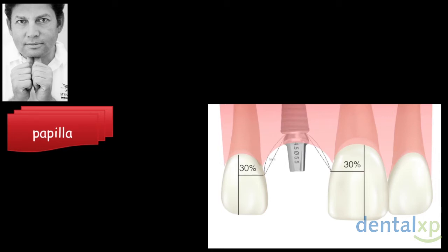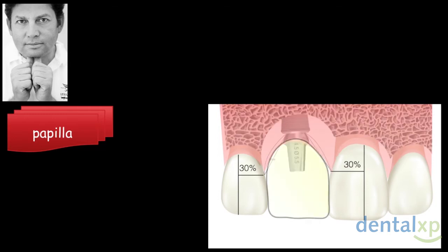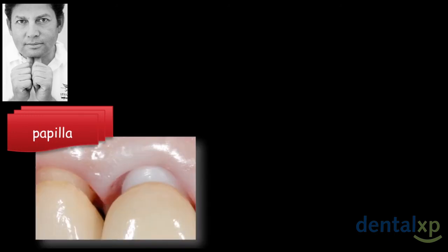If you follow this design, how much pressure are you going to have interproximally? Where is the future contact point to be? How will the soft tissue predictably grow in the interproximal space? You can avoid many times using temporary crowns. So by using this design, we don't use so many temporary crowns anymore. We almost eliminated them because we know biologically how much soft tissue will grow interproximally. How is the gingival margin prepared?